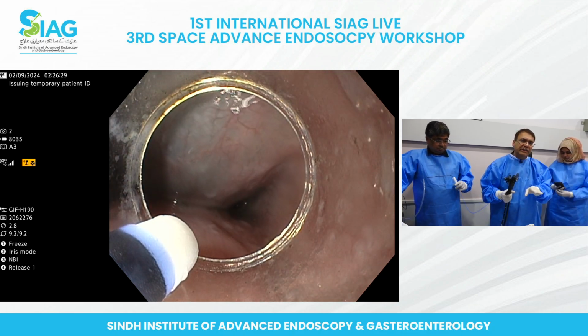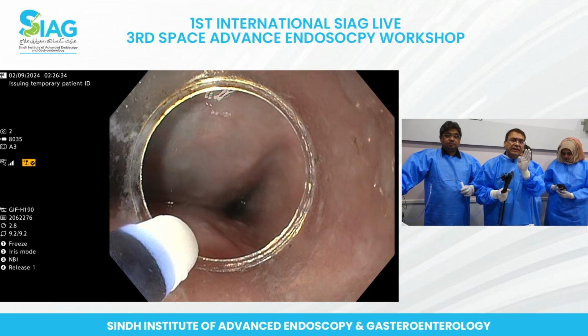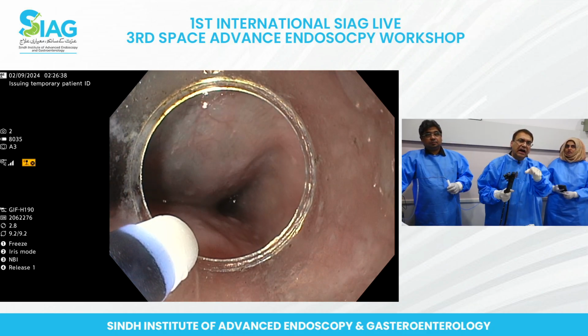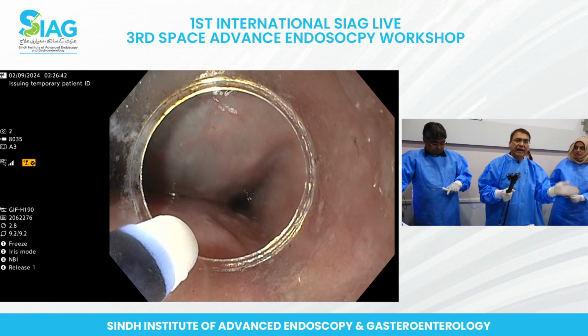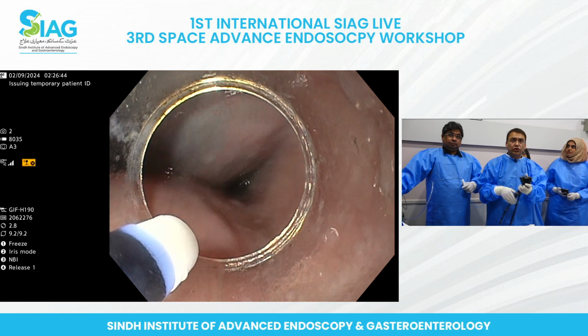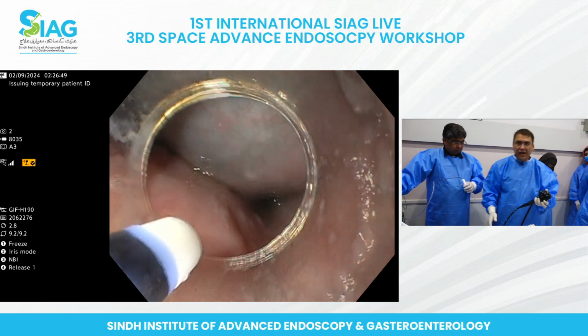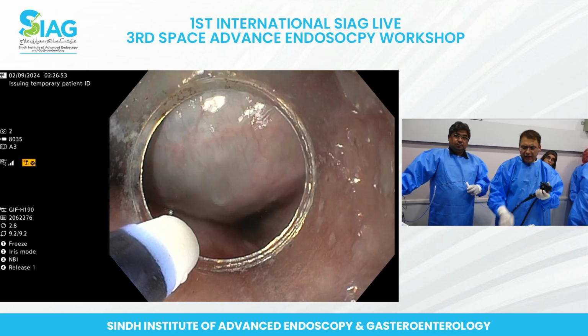The problem that can happen is if you want to do an injection and the knife is out deep into the submucosa, you think you're pressing a jet paddle and instead you press a cautery paddle, and that is called trauma. So to avoid that, this way I don't have to keep looking at those foot paddles. I put those on two different sides.